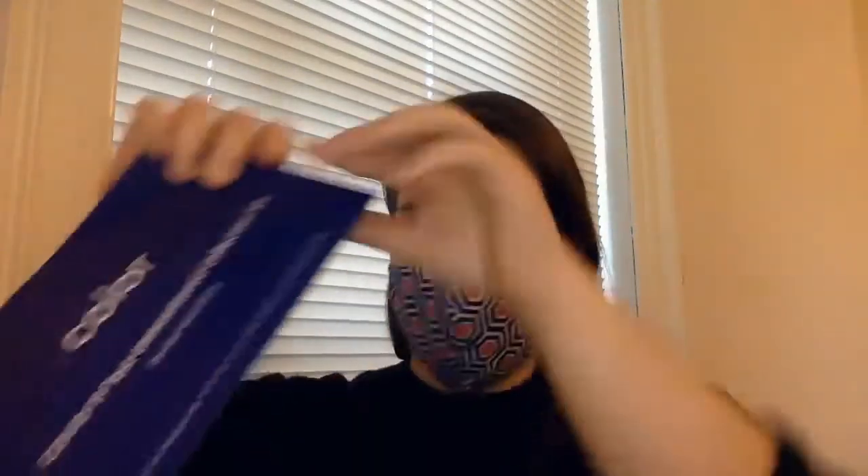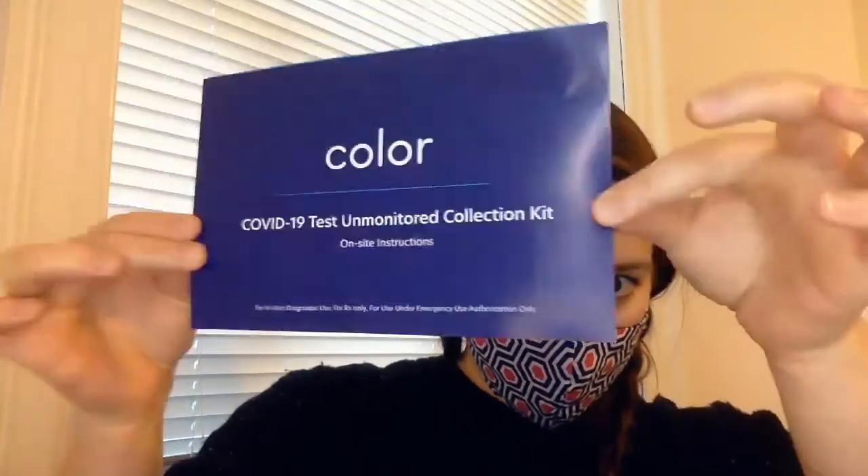So each week when I walk in, I just pick up a bag from someone sitting in the front. It looks just like this. So this ends up being our biohazard bag that we put the sample back in. I'm just going to pull out the different components like I'm unboxing it. First, each kit comes with a little instruction manual, and it just shows you the process of how to collect your specimen and to safely put it in the bag and how to dispose of it.